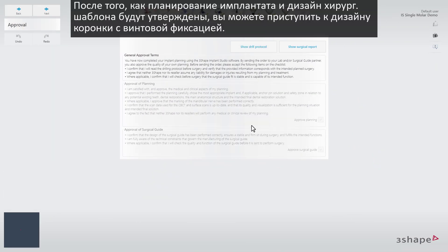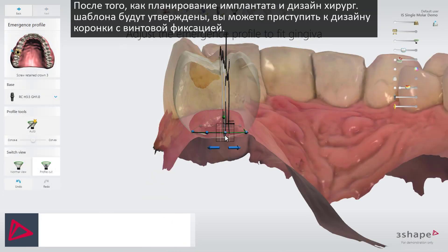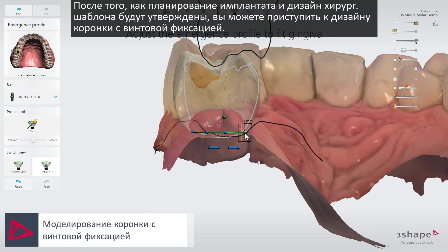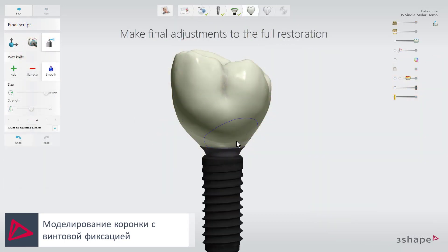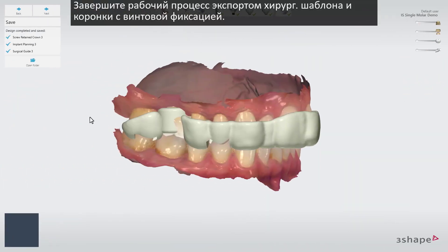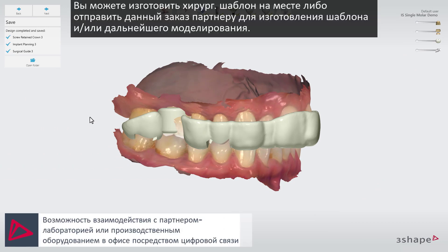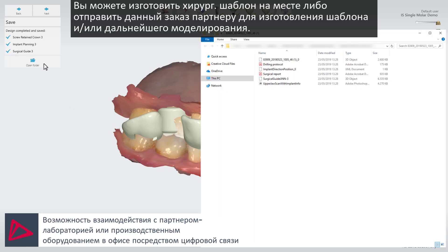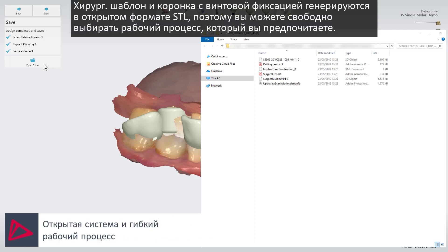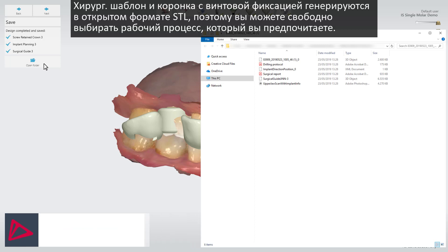Once the implant planning and surgical guide design are approved, you can now design a screw-retained crown. Finish your workflow by exporting the guide and screw-retained crown. You can then either manufacture the guide and restorations in-house, or send the case to your preferred partner for guide manufacturing and/or further design. The guide and the screw-retained crown are generated in an open STL format, so you're free to choose the workflow that you prefer.